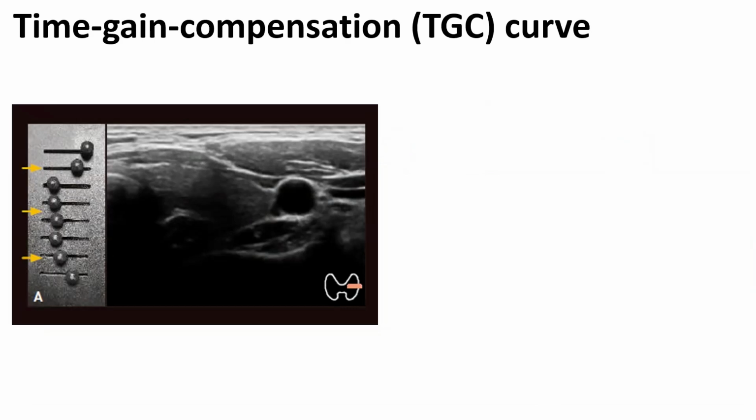When you use an ultrasound device for the first time, you may be afraid of how to learn and use it well because of too many function keys. Experienced researchers are always interested in new functions and challenge themselves. But in the case of a usual examination, there is no problem with the test by knowing only a few functions well. Residents who are not experienced in ultrasound usually perform the examination without much knowledge, using an ultrasound device because the machine has been well set by other experienced doctors.